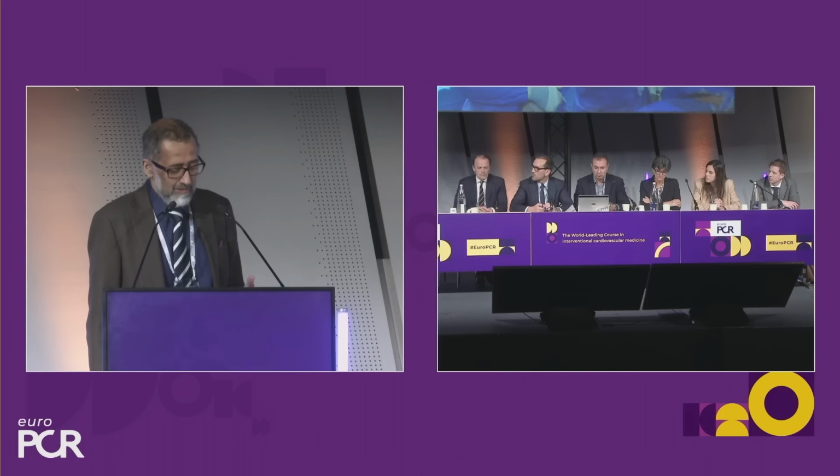Obviously, for balloon expanded valves, we pace at 180. I've had to pace at 300 in one of my latest balloon expanded valves because the ventricle was just so aggressive that the pressure wasn't dropping. But here I don't want the pressure to drop. It's a conscious patient. And I've got a very stable deployment.